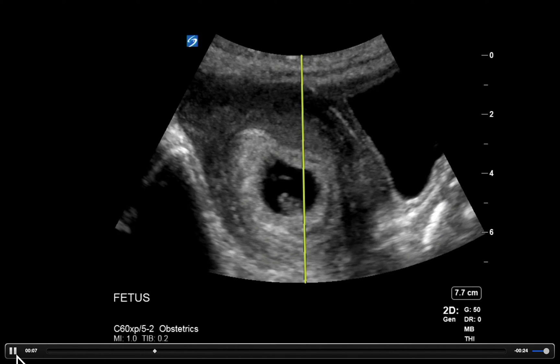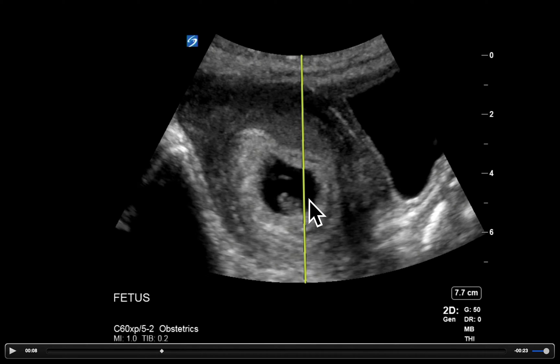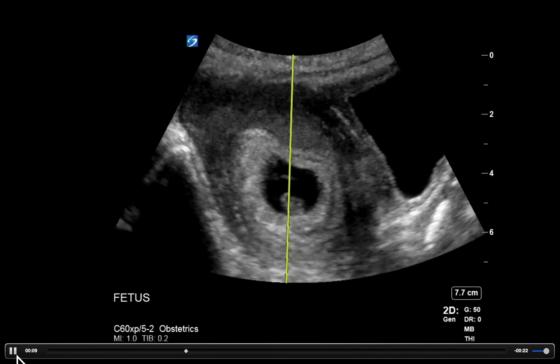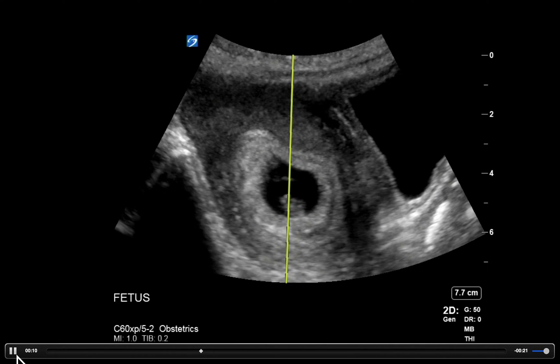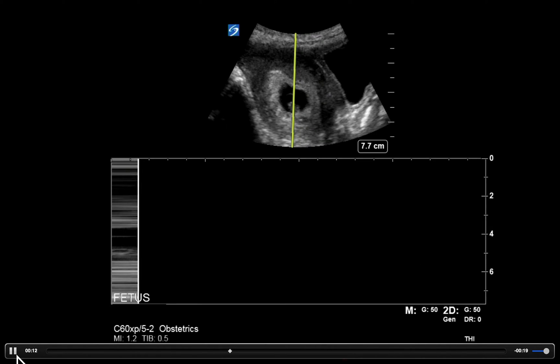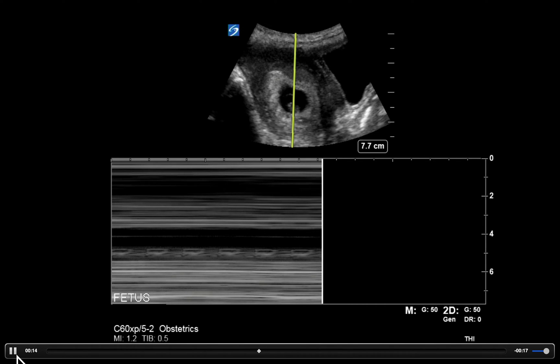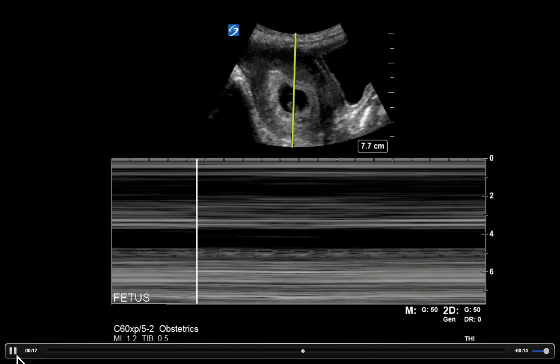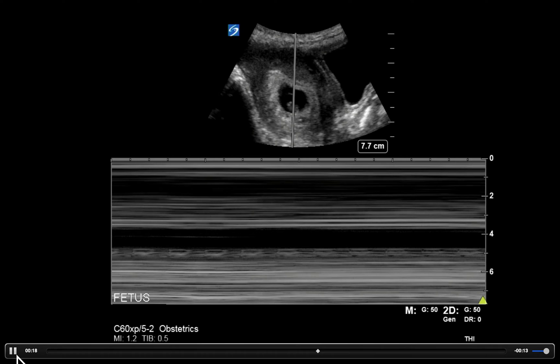M-mode is going to give us this line, and we're going to take that line and put it over the fetal heart — you can see just a little flicker on the screen. Then we hit M-mode again or start, and we get a tracing that comes across the screen. That tracing is measuring what's happening at that ultrasound beam over time.